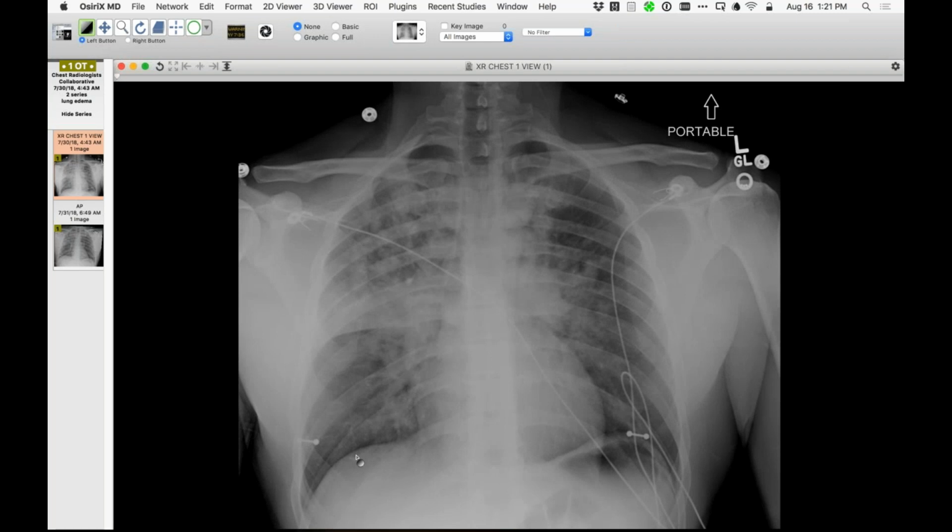We have one mountain range called the Uinta Mountain Range. He went up to the peak, Kings Peak, which is the highest in Utah at 13,000. And somewhere on the way down, he started to not feel well. He was actually descending, and he wasn't feeling very well at all, quite short of breath. So he came into hospital with this radiograph. No alternative explanation other than HAPE, high altitude pulmonary edema, could be discerned.